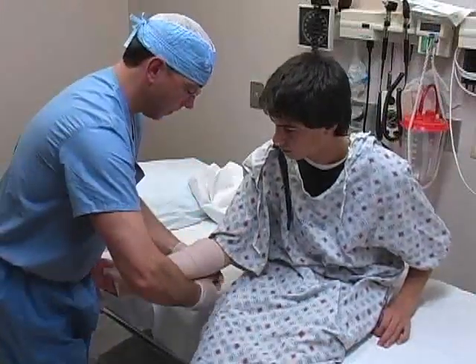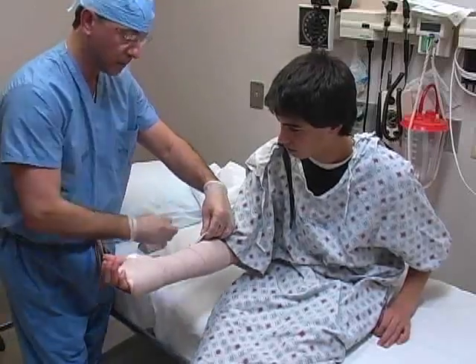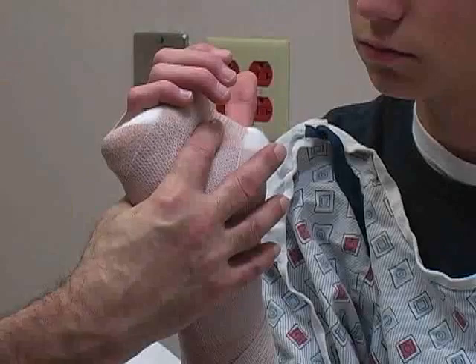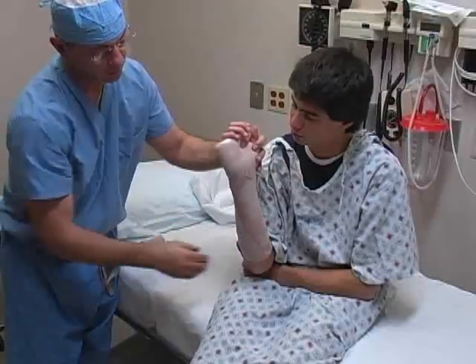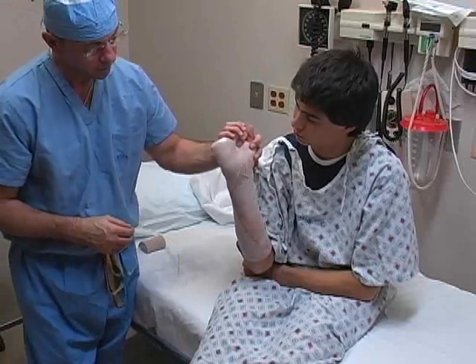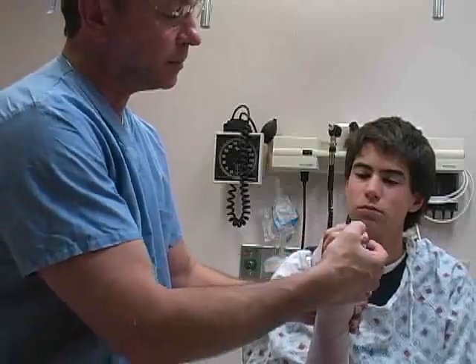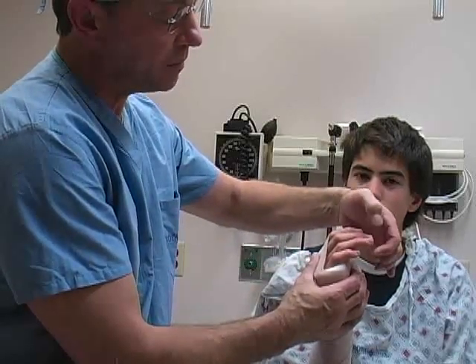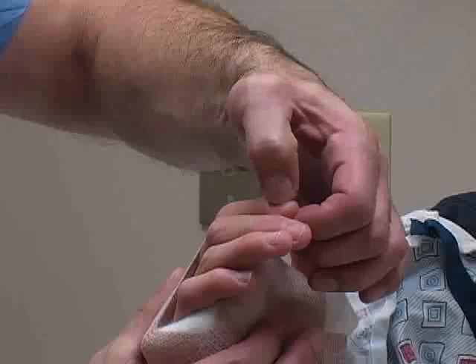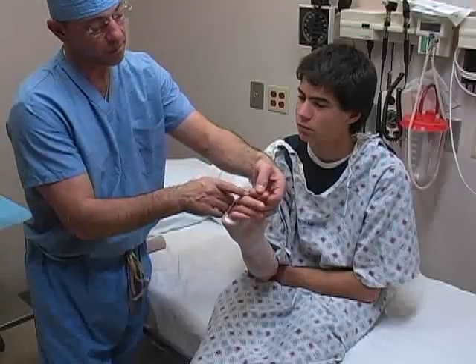Once the elastic bandage has been applied, additional positioning or molding may be performed before the fiberglass cures. Repeat a thorough neurovascular examination of the affected extremity after the splint has been applied. This examination should include capillary refill and motor and sensory function.